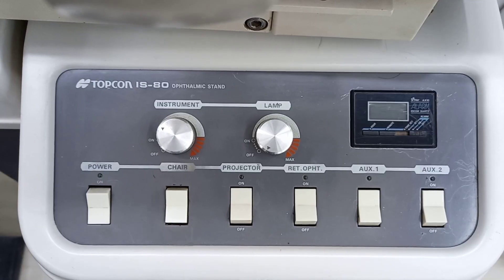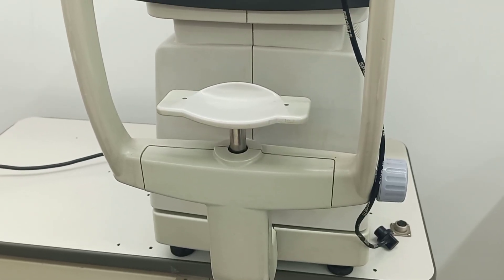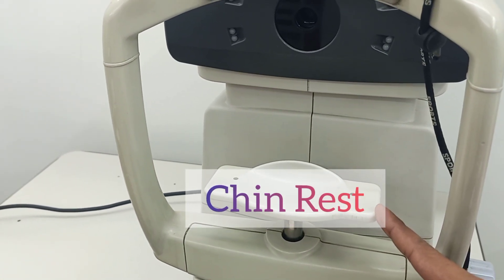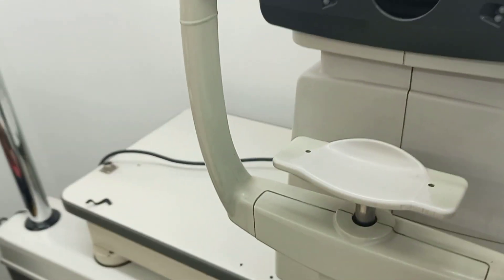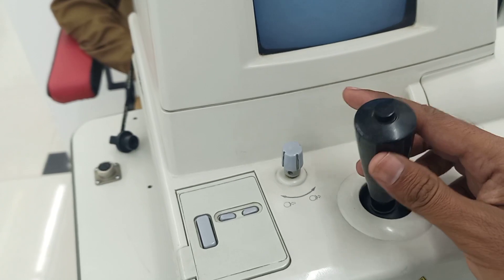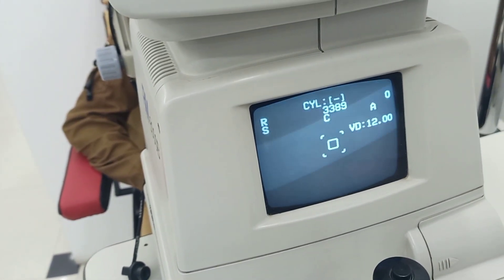We have a patient of 15 years of age and we will perform the auto refractometer. The different parts include the chin rest, where the patient puts their chin, the headrest, the joystick for the examiner, and the screen.